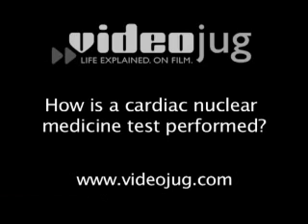How is a cardiac nuclear medicine test performed? The cardiac nuclear medicine test is performed after the patient arrives in the clinic. Basically, they are interviewed, again, making sure that the test is appropriate, and the patient has been prepared adequately and appropriately. Then they usually receive what we call a rest scan, and that is that the patient is injected intravenously with an appropriate radiotracer, and then after a few minutes they are placed into a scanner, and images of the heart are obtained. These are called the rest images.